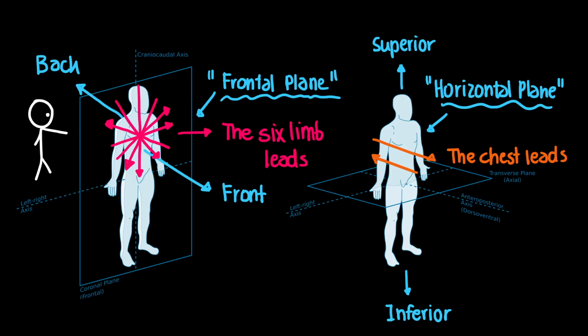Together, they cover everything. The frontal plane plus the horizontal plane, 2 planes with 12 leads, giving us the full picture.